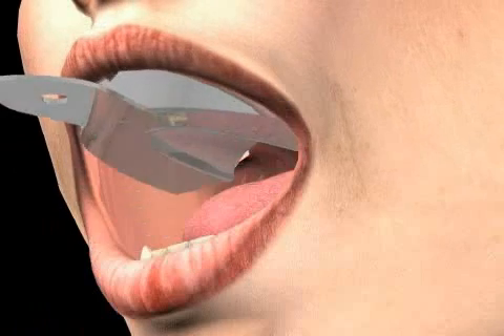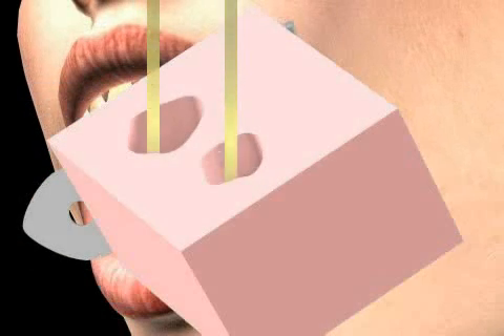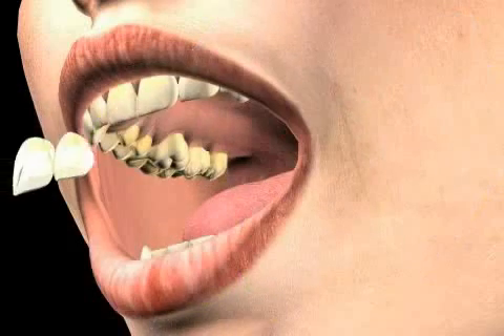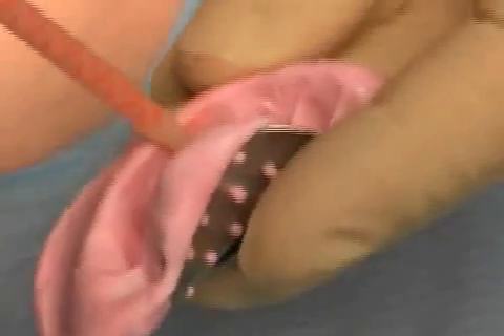After the cutting of the teeth, in this case for veneers, the liquid compound is inserted into the negative copy and placed over the cut teeth. The synthetic material hardens, yielding a temporary prosthesis. You see how the initial impression material containing Luxatemp is placed over the teeth.